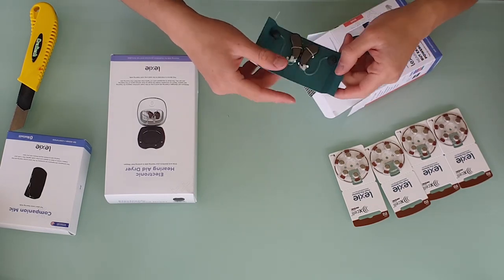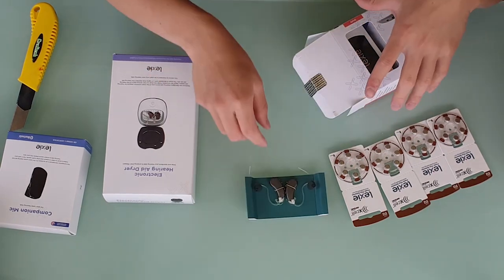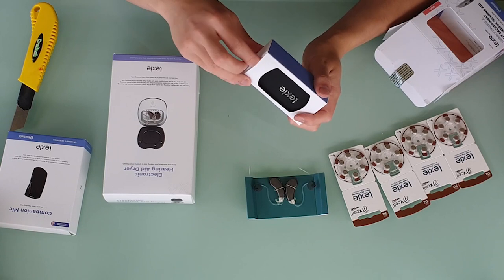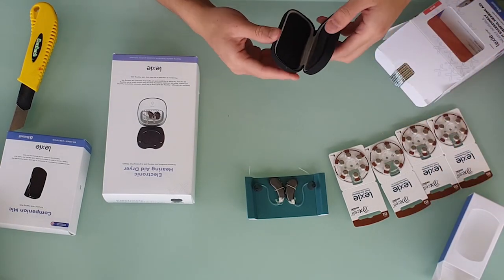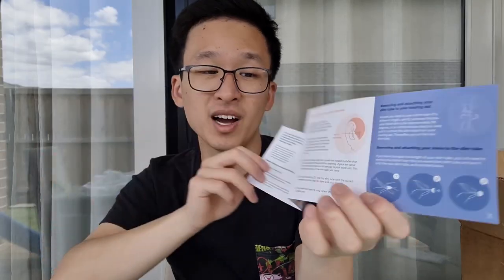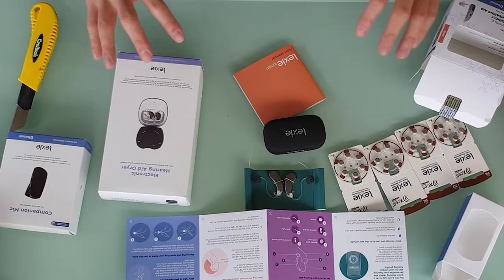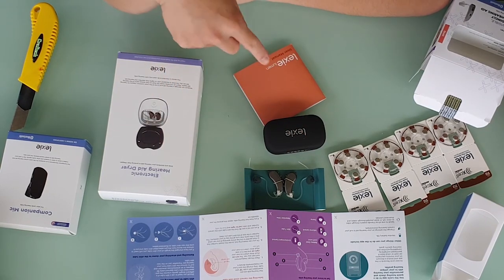So let's crack open the Lexi Lumen hearing aids. The first thing you want to pull out is the hearing aids themselves — you can see there's a battery door there, we'll take a better look at that later. There's also a nice carrying case if you want a place to store them, an instruction manual, and a quick start guide covering how to get the right fit and tube sizes. They also go through written and animated steps on the Lexi Lumen app.